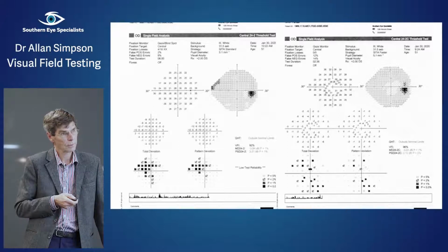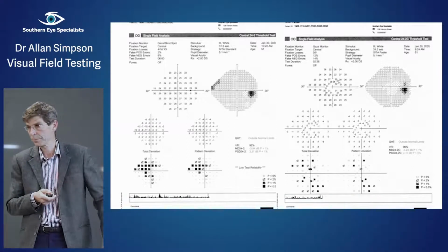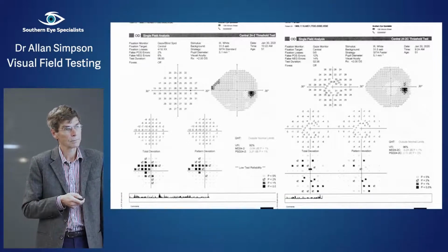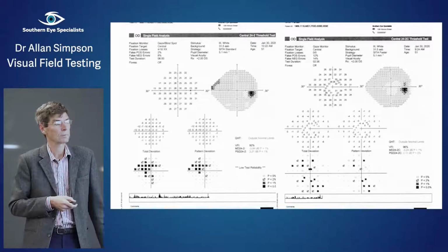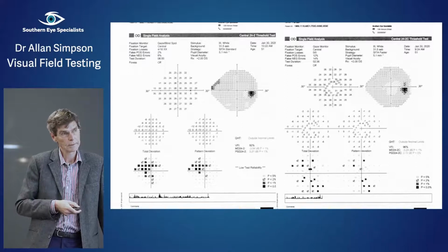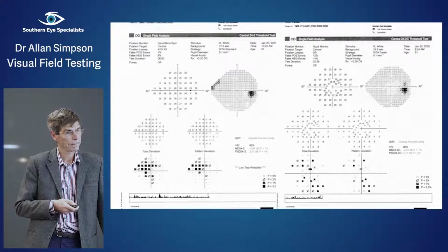So you see what I mean about all these extra tests in the middle. It's a little bit higgledy-piggledy. They don't seem to have much logic to them, but they have been chosen as best representative of those that might pick up central field loss and glaucoma. So they've been put in there for a reason from that 10 degree additional field grid. And so you see the extras there.